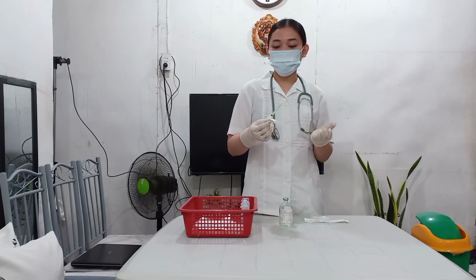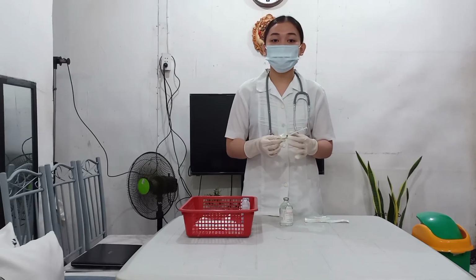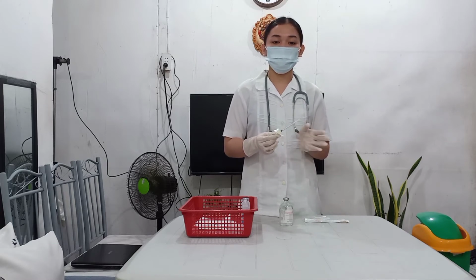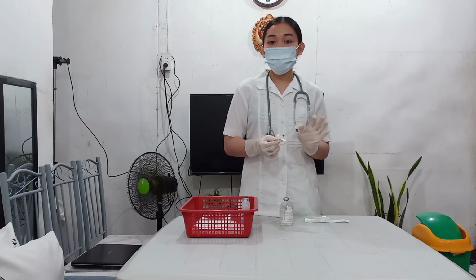Now, since I've already attached the filter needle on my tuberculin syringe, I will remove the cap from the needle, then draw up into the syringe the amount of air equal to the volume of the medication to be withdrawn. Before fluid is removed, injection of an equal amount of air is required to prevent the formation of a partial vacuum because a vial is a sealed container.